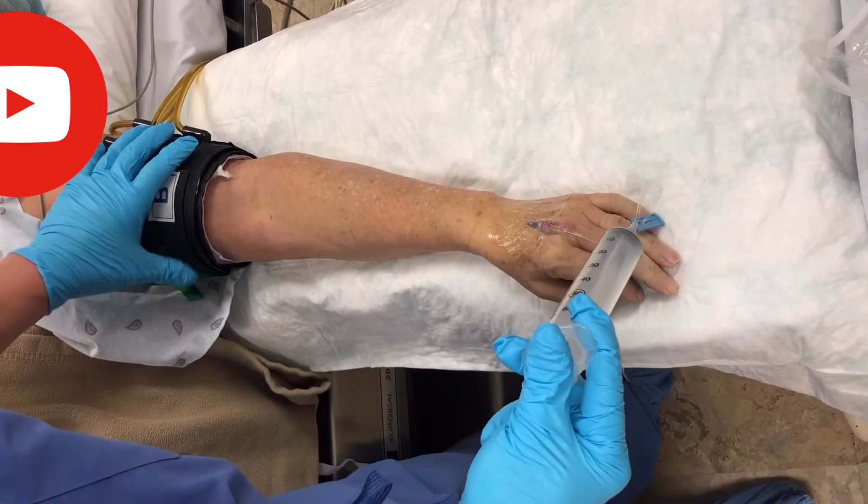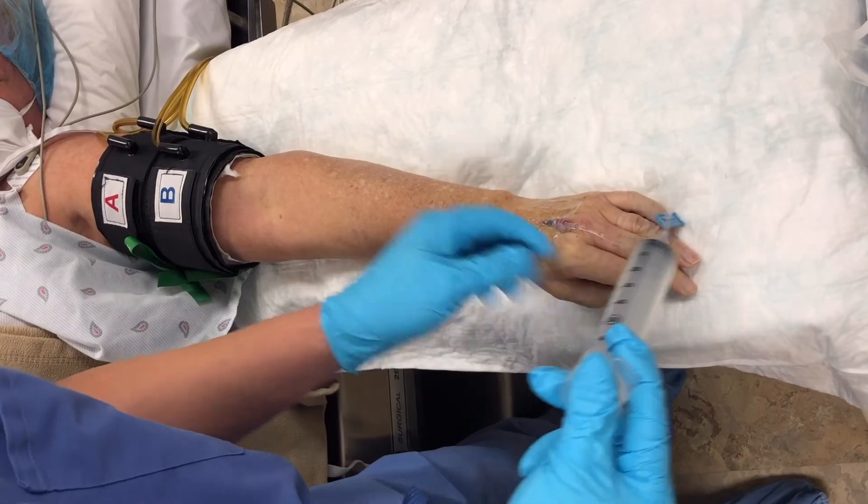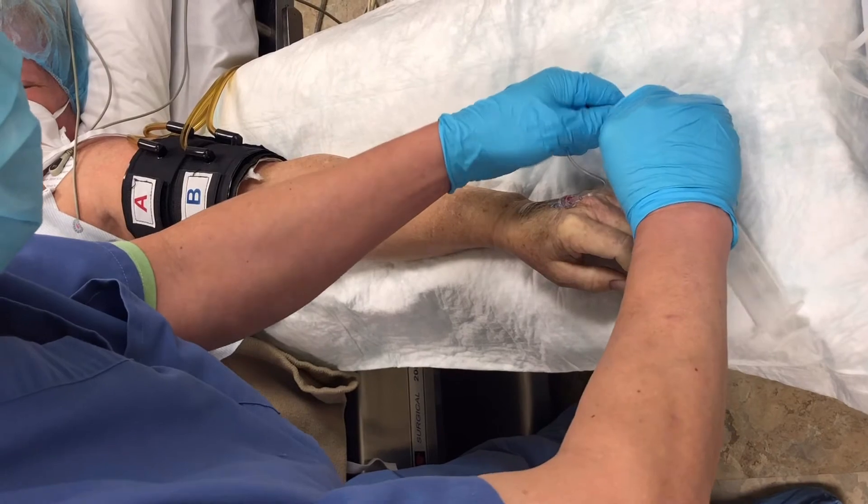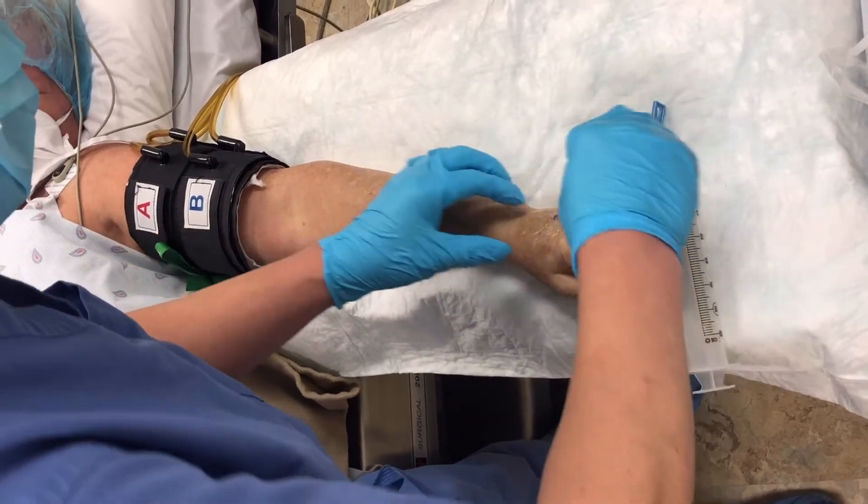If you put the tourniquet at the forearm, you can inject just 30 cc. Now the injection is complete. We're going to remove the IV.